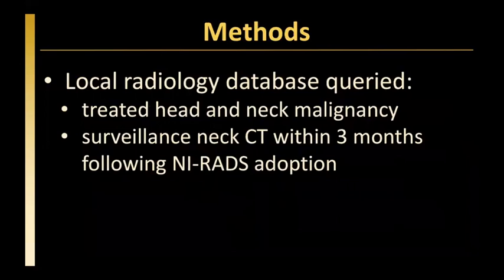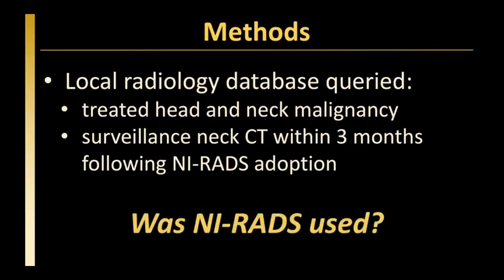In addition to administering these pre- and post-surveys, we also wanted to get a sense of how frequently NIRADS was actually being used for neck CT reporting after optional adoption by the neuroradiologists. To do this, we performed an IRB-approved HIPAA-compliant search of a local radiology report database to identify patients with previously treated head and neck malignancy who underwent surveillance neck CT within 3 months following NIRADS adoption. And we asked a simple question: was NIRADS used?